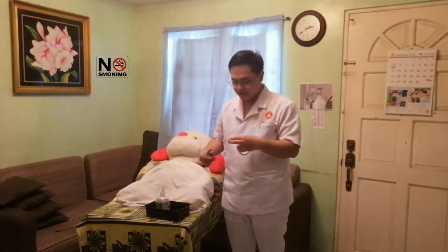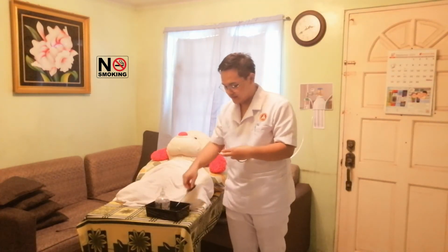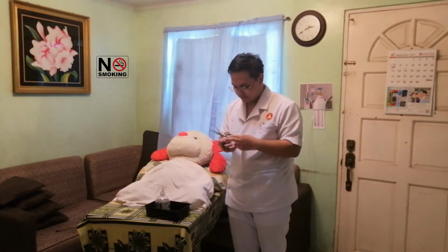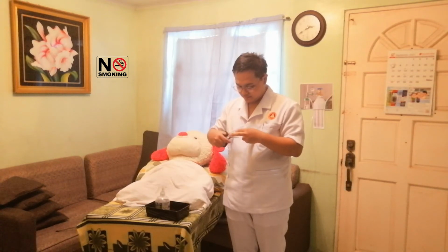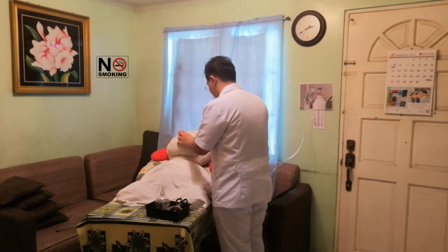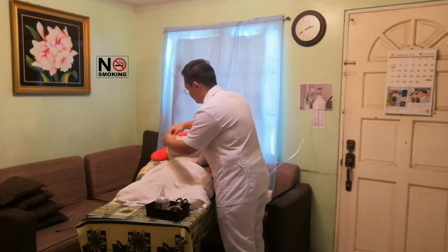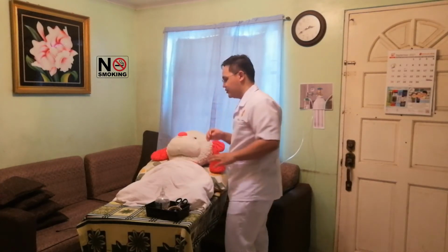We will be taping it on the client's side of the face. Okay. Okay, that should do the trick.